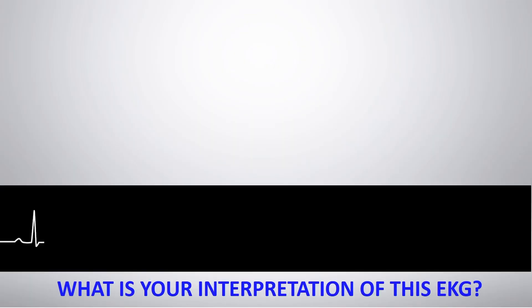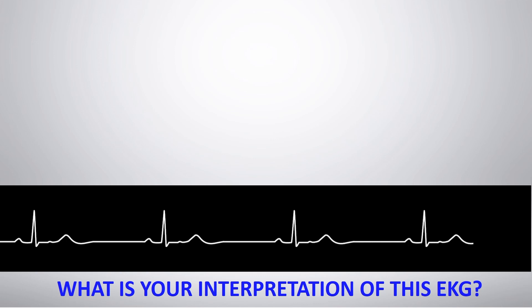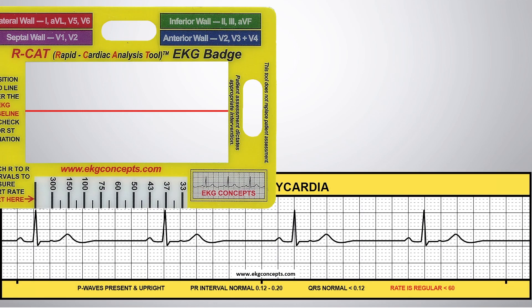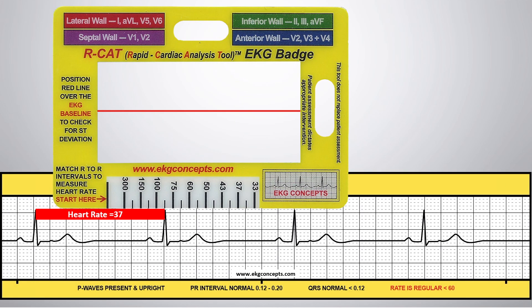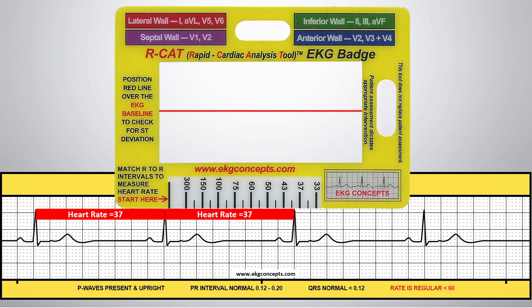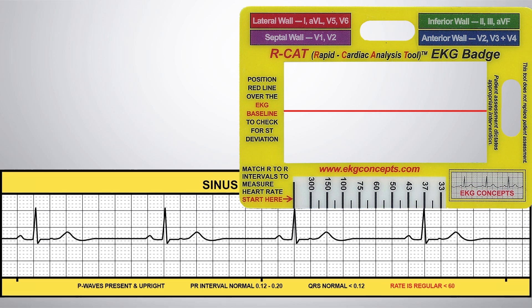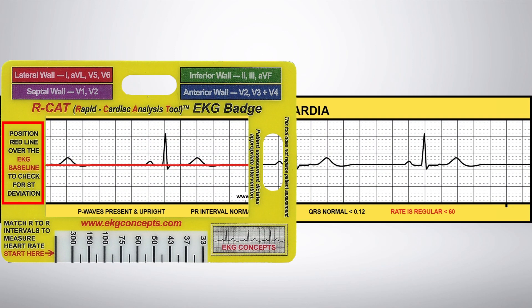What is your interpretation of this EKG rhythm strip? Sinus bradycardia. Using the EKG badge to accurately and quickly confirm, match the R to R intervals to measure the heart rate. The heart rate is consistently 37 beats per minute, which is less than the normal 60 beats per minute.